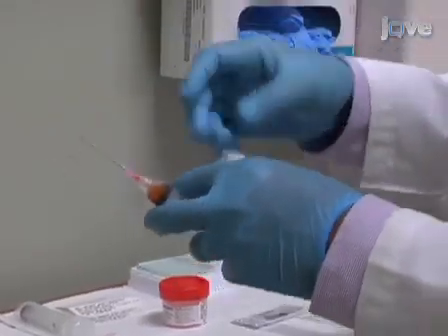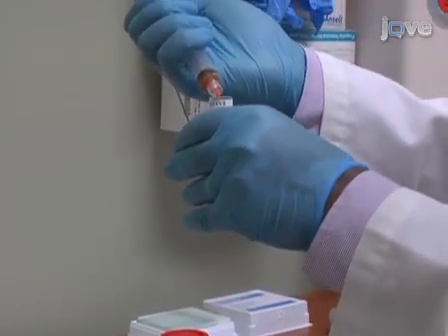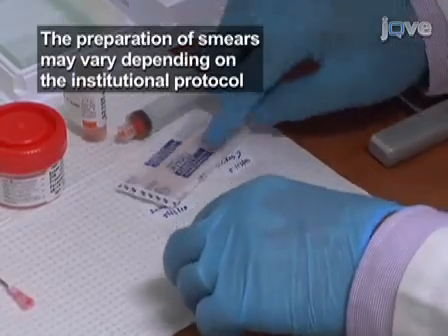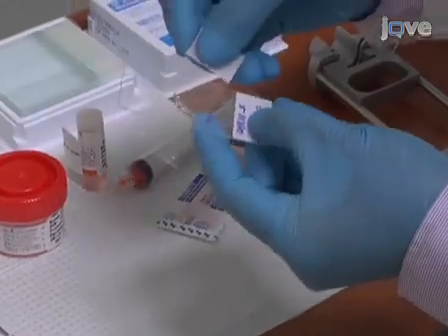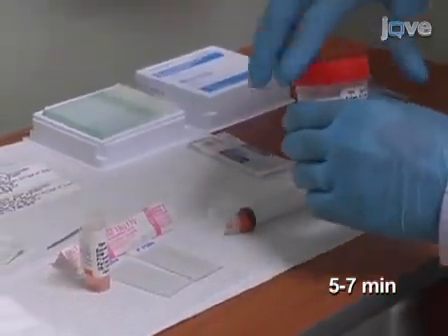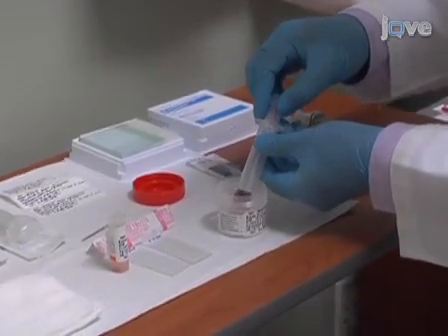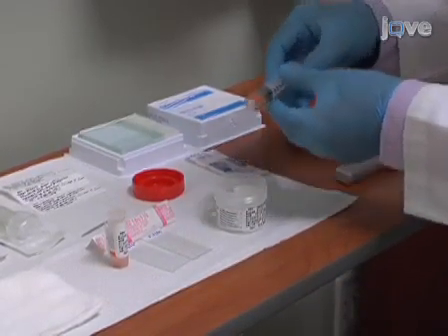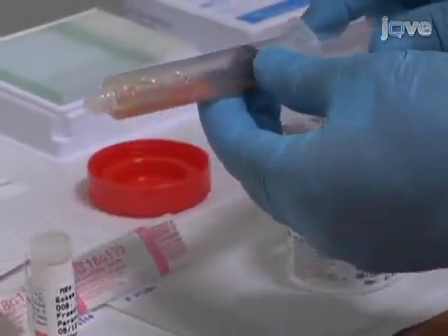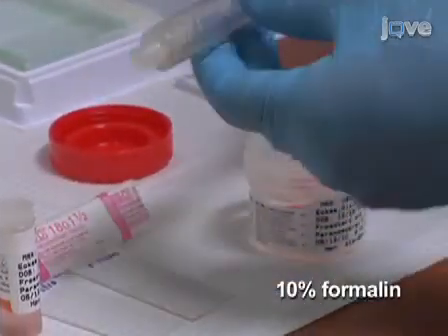Remove the syringe needle and transfer 5 to 6 fragments of fibroadipose tissue into 2% glutaraldehyde solution through the nozzle of the syringe. Dispense additional small fragments of tissue through the nozzle onto a glass slide and spread between two slides to prepare smears. Allow the remaining material to clot in the syringe; this may take 5 to 7 minutes. Next, aspirate 10% formalin into the syringe so that the clotted fibroadipose tissue material is dislodged from the wall of the syringe and free floating. Remove the plunger from the syringe and transfer the clotted fibroadipose tissue into the labeled 10% formalin container from the open end of the syringe opposite the nozzle end.